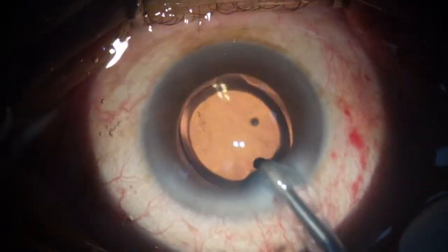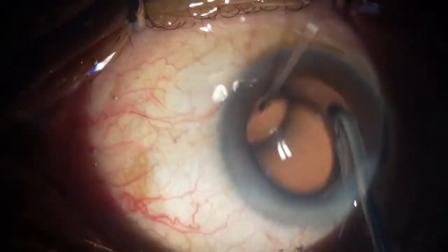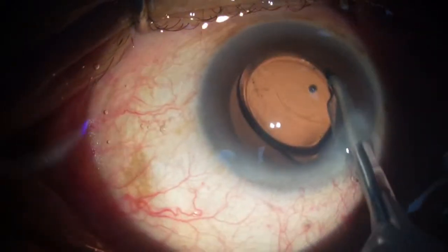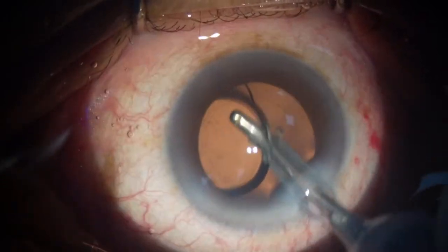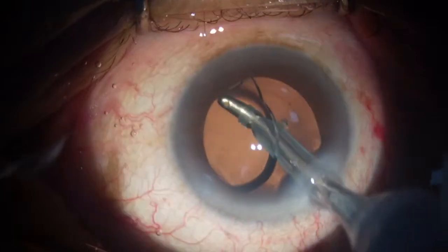behind the, and then I go behind the IOL. So I went behind the iris, and then I will go behind the IOL and do with my port up. I'm just removing the visco from behind.